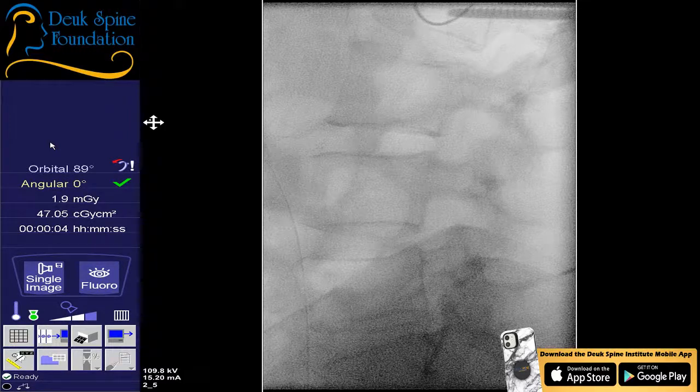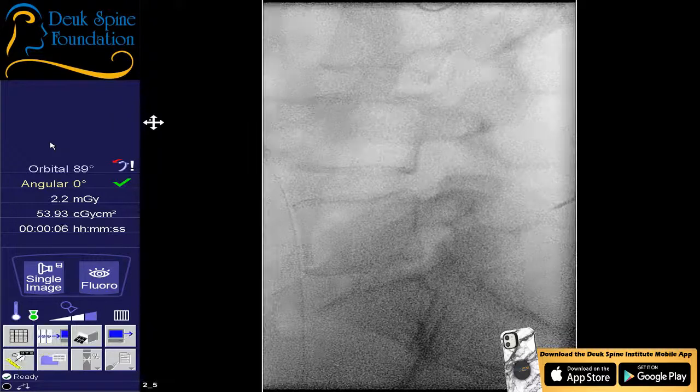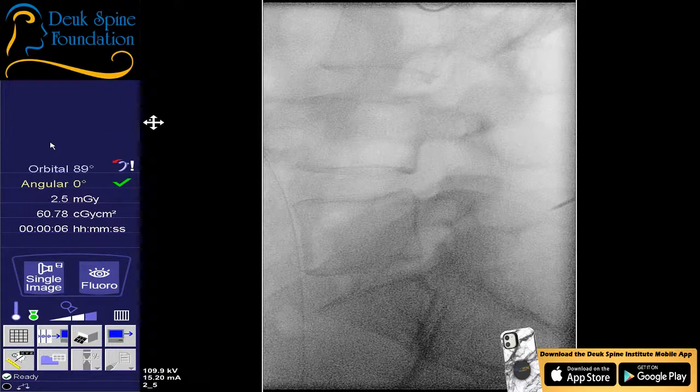That's worse. So remember what we talked about, folks. You need to get the X-ray lined up with the spine before you really do anything. If you don't, then you could end up putting the equipment for the surgery in the wrong place. So the first thing we have to do is line the X-ray up with the spine. That looks pretty good. And we're doing 4-5-5-1. Everybody's in agreement. Why don't we leave it there and see what we've got.